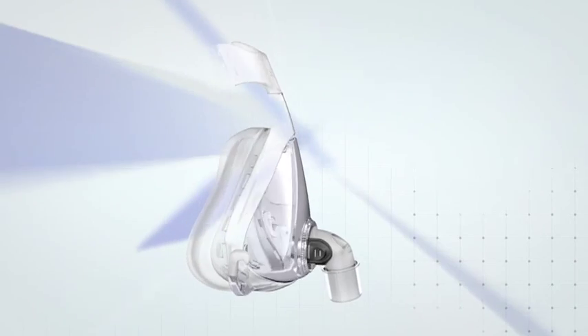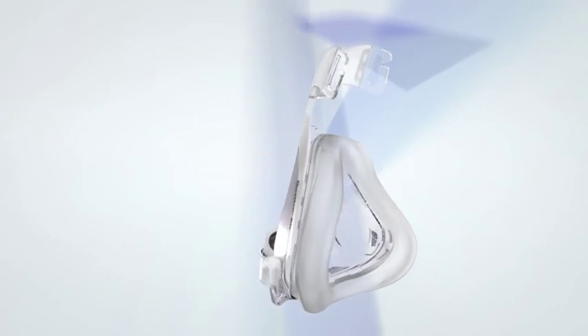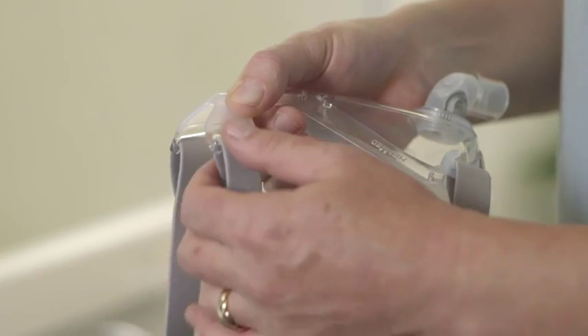Congratulations on choosing Quattro Air, the lighter way to better sleep. As you're about to discover, it's easy to clean. Quattro Air has just four parts.